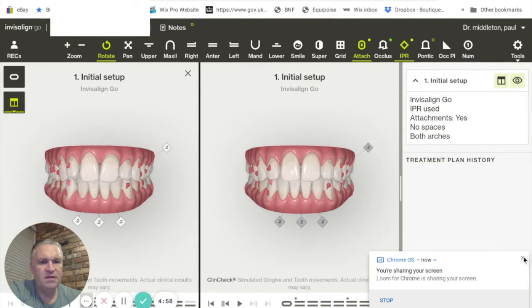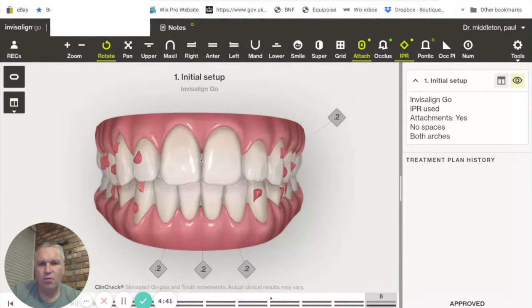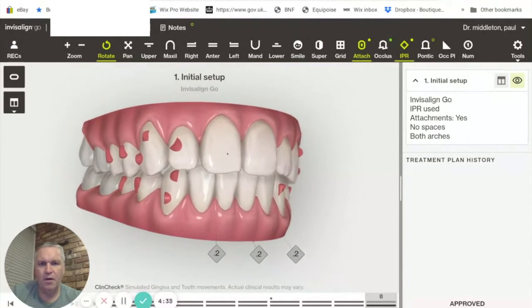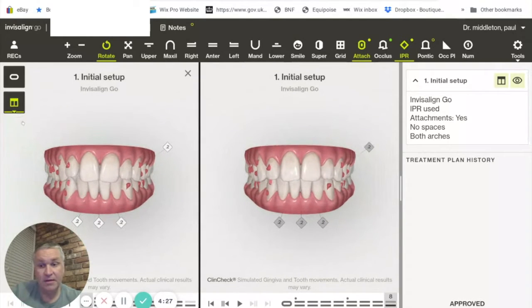So this is a Clincheck plan which we receive back from Invisalign when we submit a scan to them. At the initial digital scan, we can do something called an outcome simulator, which gives us an almost immediate before and after scenario. If you as the patient are happy with that and want to proceed, then the next step is the Clincheck here, which is a more accurate version and gives us more details about what the treatment is going to entail.